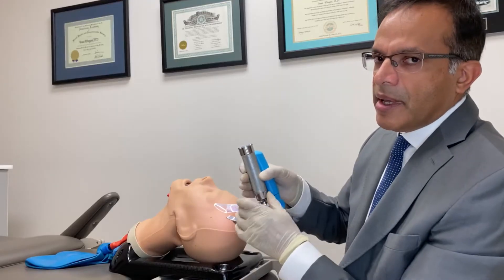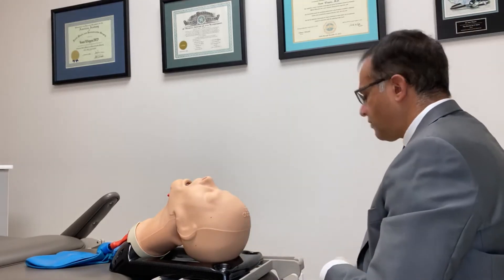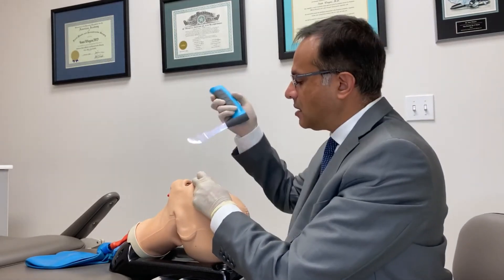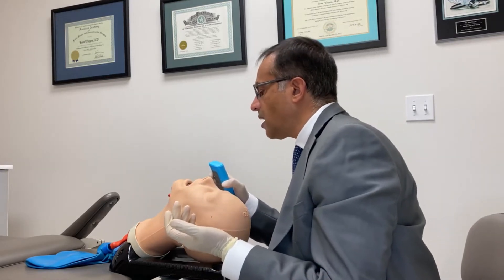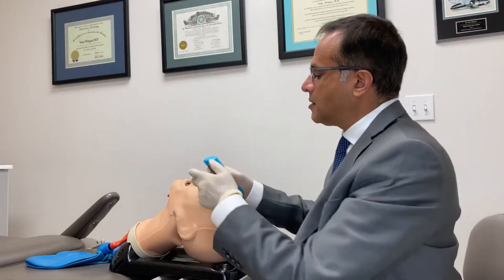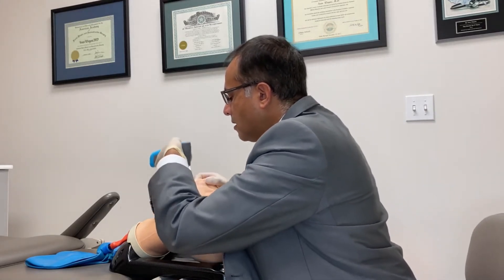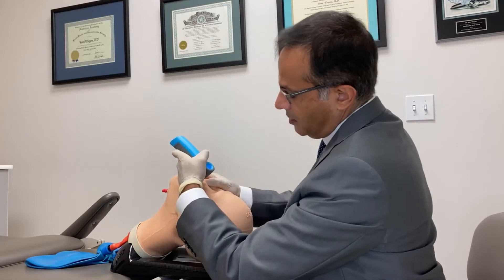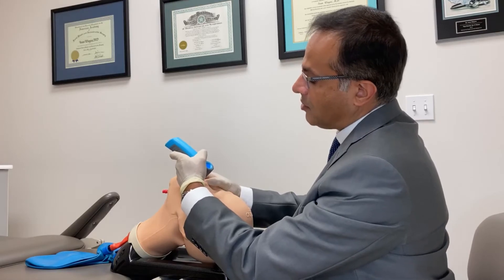Everything with this device is intentional. We always examine the teeth before placing the v-scope, then consider: if there's damage on one side or very poor dentition, why not go to the other side? The v-scope allows you to do that. If this mannequin has poor teeth on the right, I go to the left, look down throughout, get underneath the epiglottis — using the TEN mnemonic: Tongue, Epiglottis, and Notch, standing for the interarytenoid notch — and I get a beautiful view.